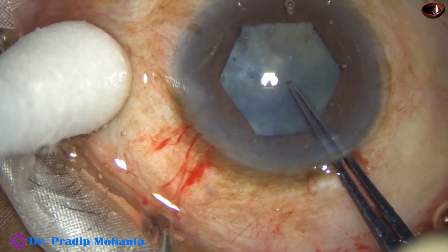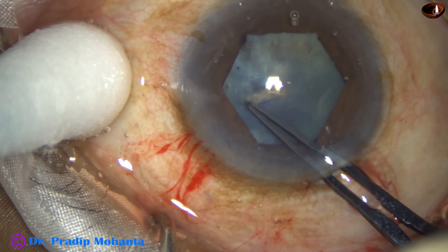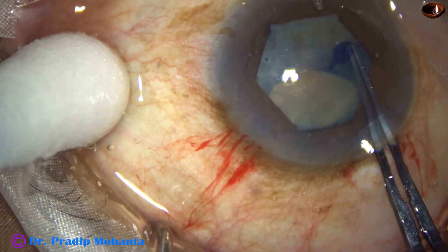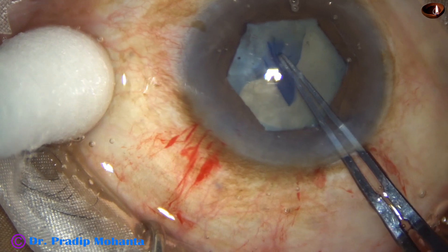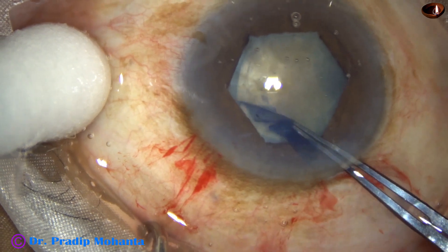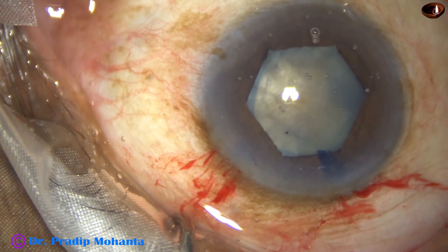Now, a rhexis with the help of the Utrata forceps. I am doing this rhexis. I want to make an adequate size rhexis because I know that the cataract is going to be quite hard — the patient is very old and the cataract is going to be quite hard. Rhexis is done.